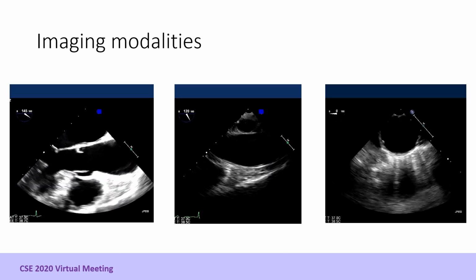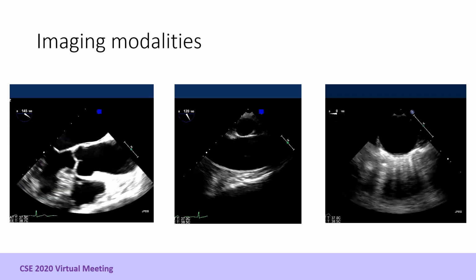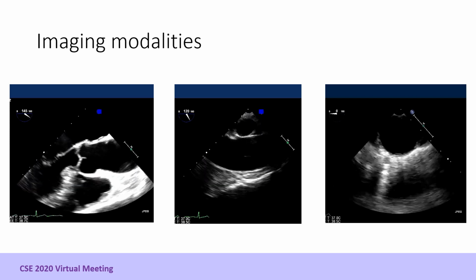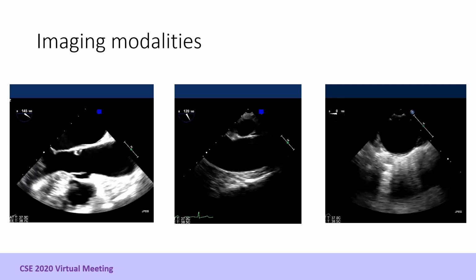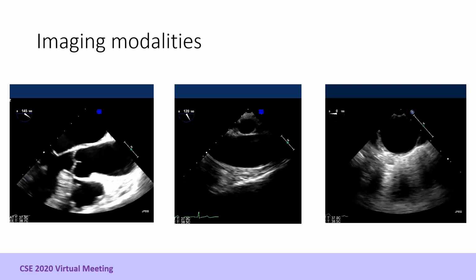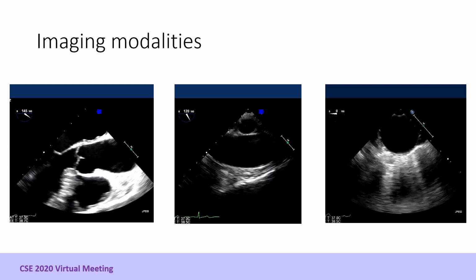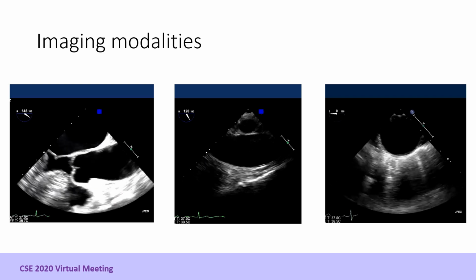Transesophageal echocardiography has two main advantages over TTE: superior image quality and better visualization of the ascending and descending thoracic aorta due to their proximity to the probe in the esophagus. The ascending aorta is typically visualized in a modified esophageal long axis view around 100 to 120 degrees and can sometimes be seen from a deep transgastric view as well.